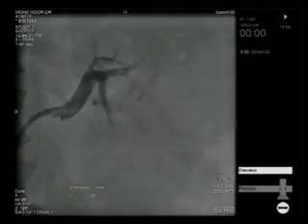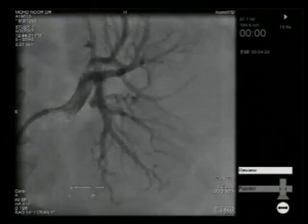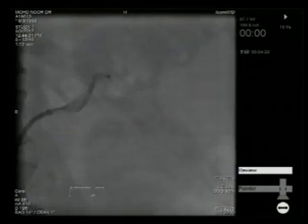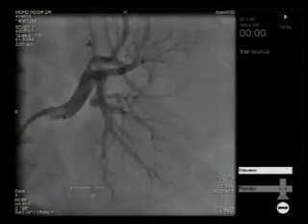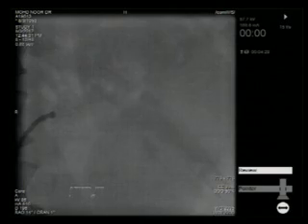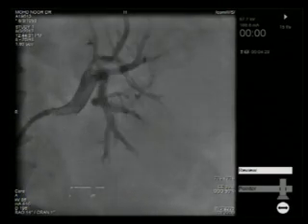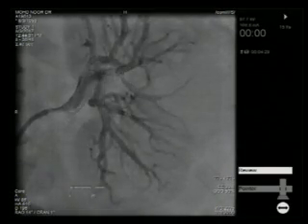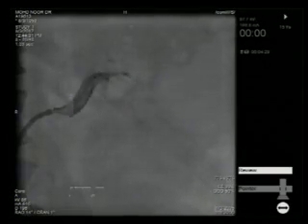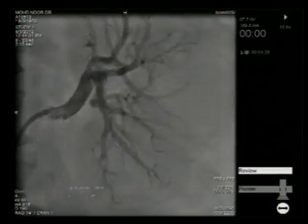Before the catheter is put in, the ostium is all right. We have taken that, that's the renal artery. We have just put a marker on the fluoro screen to show where the distal bifurcation of the renal arteries is. So we want to start the delivery of the lesion at the distalmost site where the vessels are going to bifurcate. Can you fluoro now?